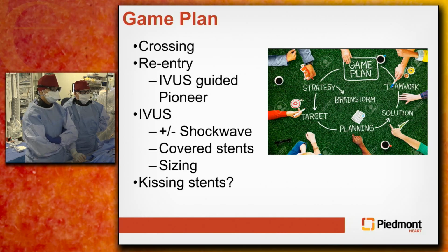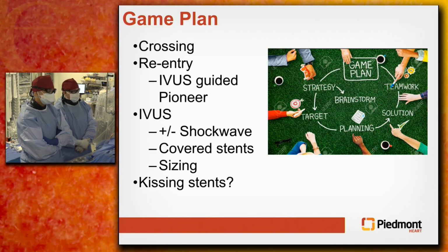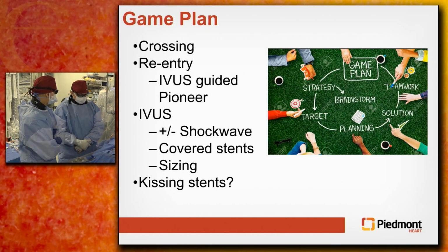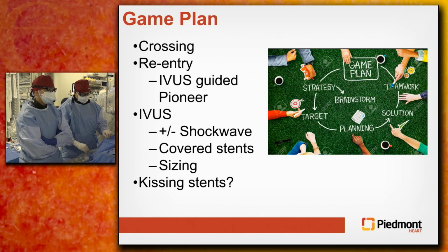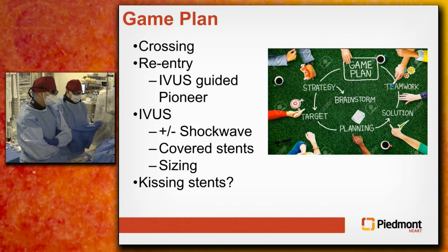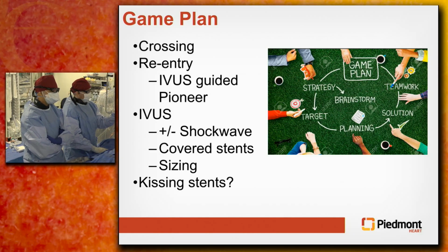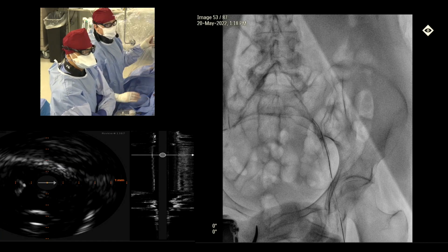So look, the initial diagnostics were quite scary looking, nasty. I think they're very nasty. But the recon more distally in the common femoral, there wasn't really much there. So initially our thoughts were to come from above and use the left radial, but we had some issues with that too. So Drew, why don't you show where we are so far and what roadblocks we've had up to this point?